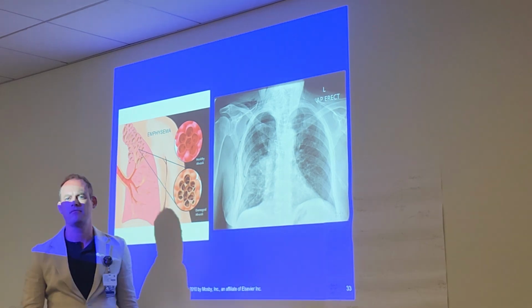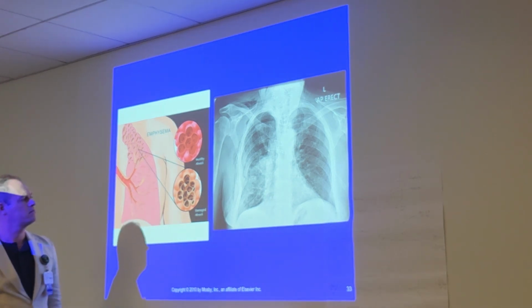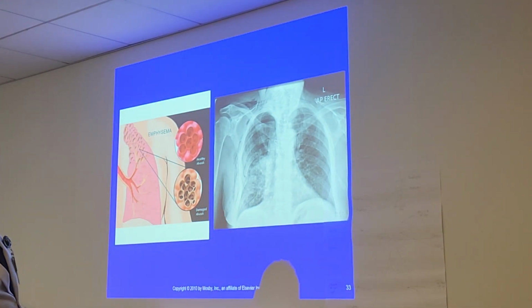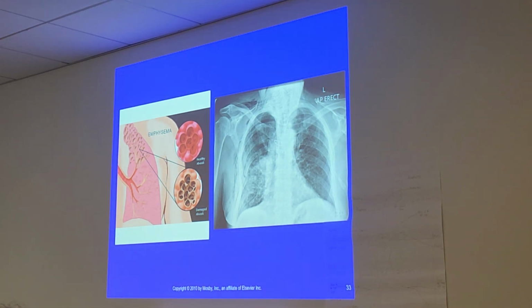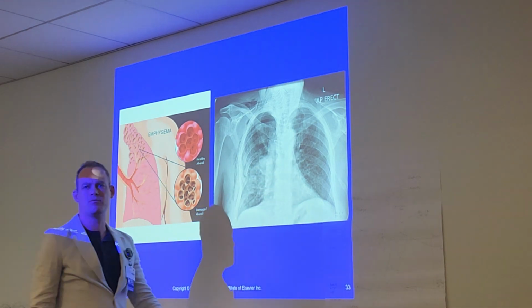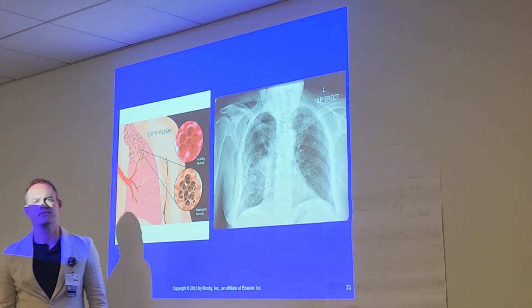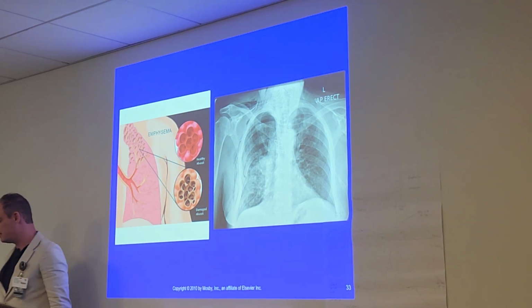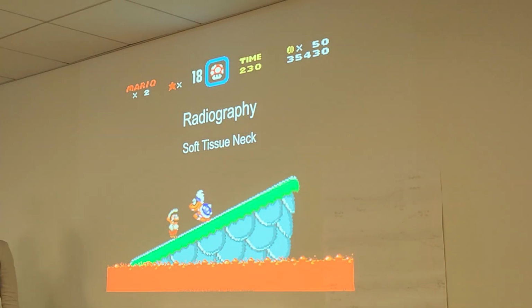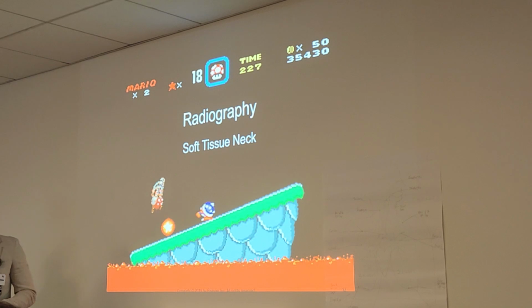What about the dark white right here beside the clips? Just calcifications? Let me see, can't really see that close. That looks like it's just part of the heart shadow, or, you know what, that might be the aorta being a little calcified. Because if I'm looking at it, aorta's up here. I know it curves down like this. That's my best guess. Or it might be the emphysema built up really bad right there. Could be the emphysema, it's all fuzzy.